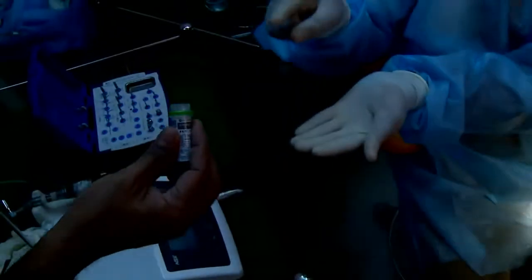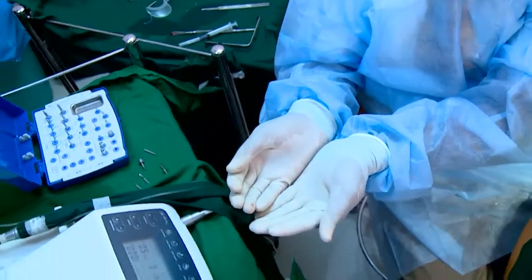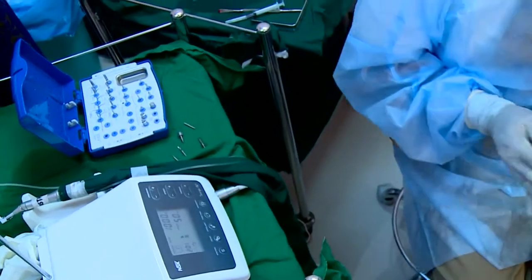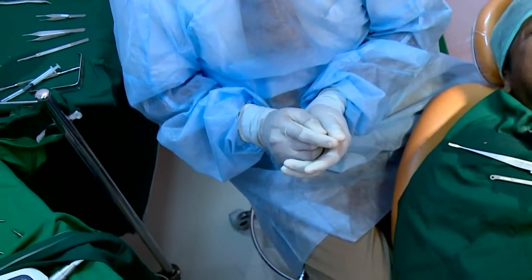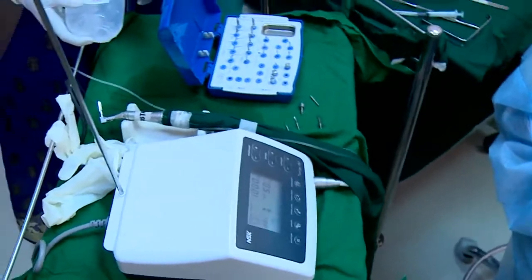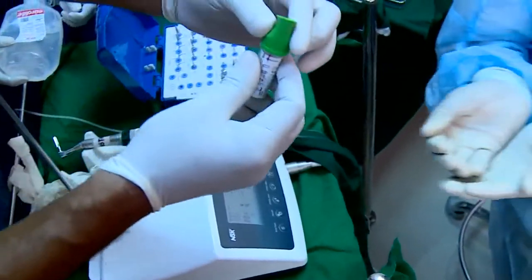Now the implants show the cover also. So sir has opened the cover and just transferred it. The last osteotomy is finished, sir? This is last but one. I am actually going to try it because I feel the bone is a bit softer. Softer, okay. Yeah, so I am going to try placing this. If I feel that it is too tight, I will reverse it.